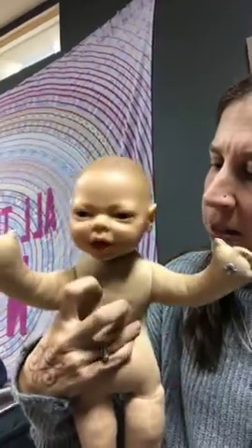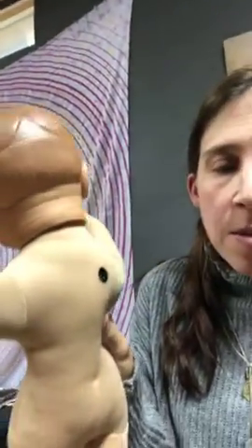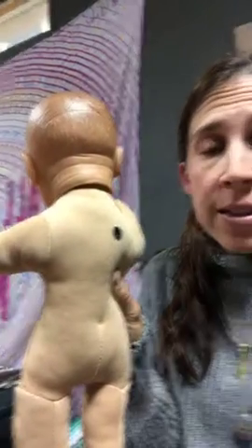And I've put a sticker on this baby's back. So this is the baby's left side, and the sticker is on the back to reflect where the point of maximum intensity is, or the PMI. And when you're listening on a mom's belly, however the baby is positioned, you are going to hear the fetal heart tones best with a Fetoscope right where this black sticker is. So of course the baby is going to be curled up and in who knows what position. Could be head down, could be head up, all kinds of variations on that I'm not going to go into today. But again, over the left shoulder blade will be where you hear heart tones the best.